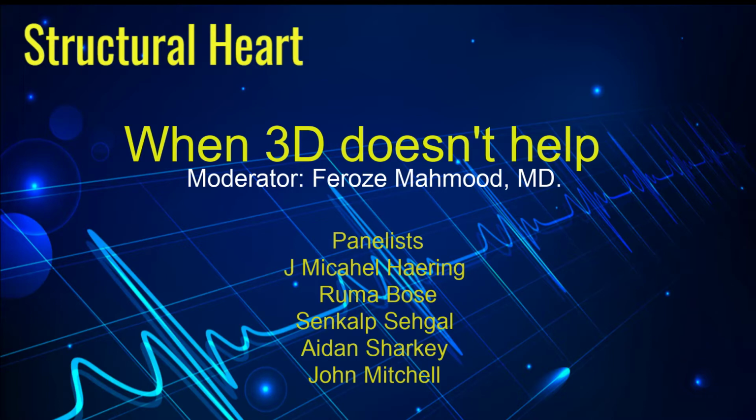In the first of this series of podcasts, we will be reviewing a case undergoing a mitral clip procedure that required a precise location of the mitral regurgitation jet, where the patient had suboptimal 3D images, and therefore we had to resort to certain other maneuvers to resolve this problem.